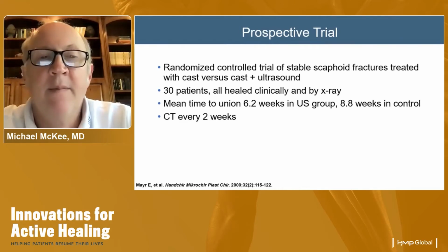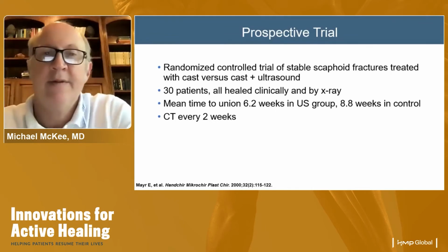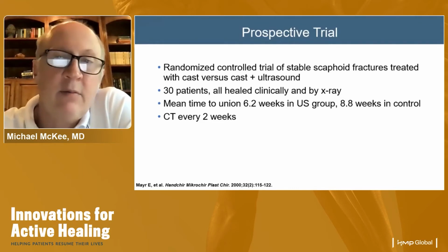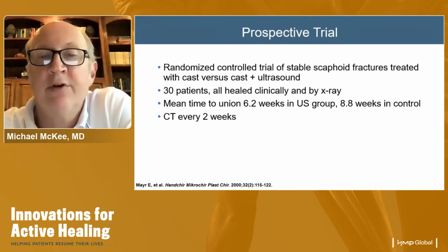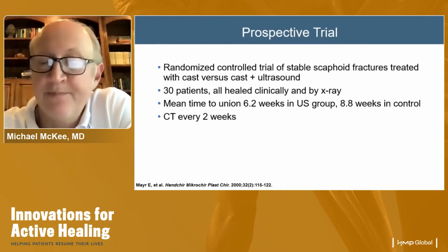So it looks as if, if you don't want to do surgery on these individuals and you want to get them out of a cast and healed as quickly as possible, there may be some significant advantages to a LIPUS application. And certainly it's become, I think, almost standard of care for many professional athletes, where return to play or return to function is critically important and a huge economic issue if you're making millions of dollars a year to play a sport.